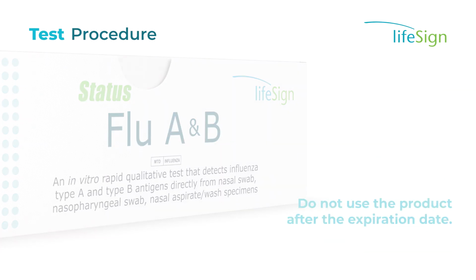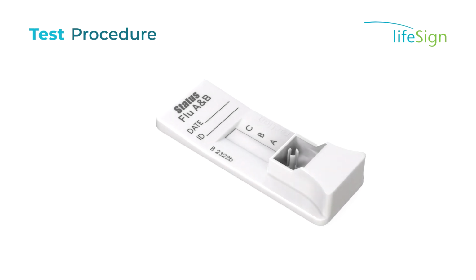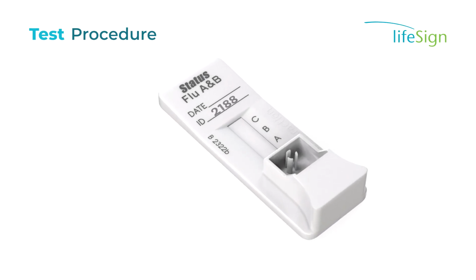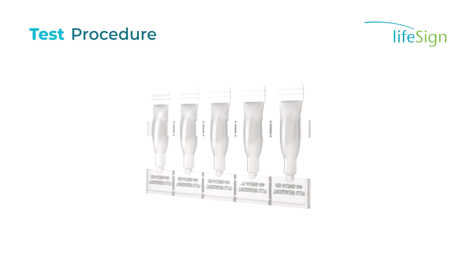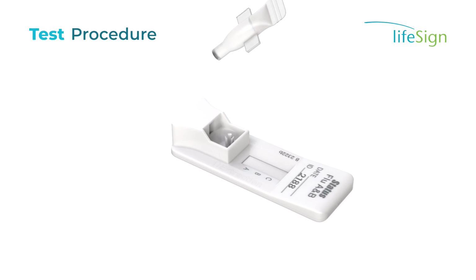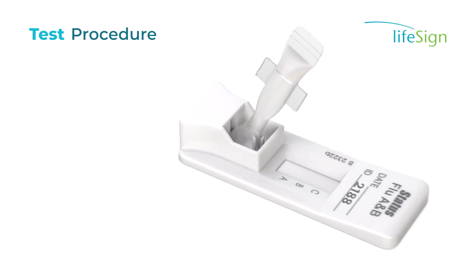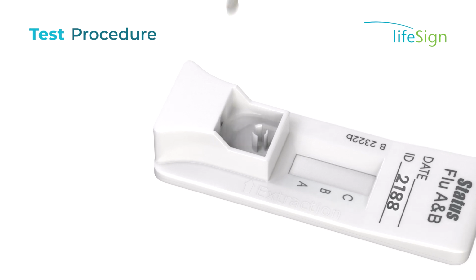Once the patient's swab has been collected, open the foil pouch, place the cassette on a level surface, and label the cassette with the patient identification. Remove 1 extraction reagent capsule from the strip and tear off the tab to open. Squeeze the reagent capsule to dispense all of the reagent into the extraction well of the test cassette.